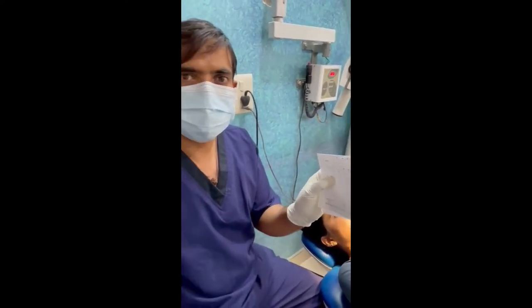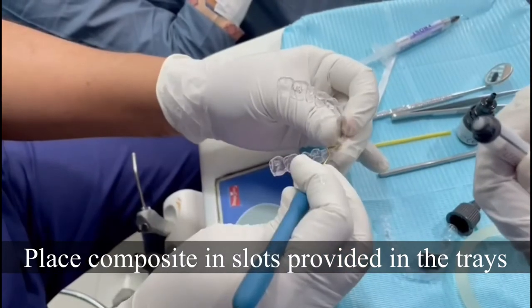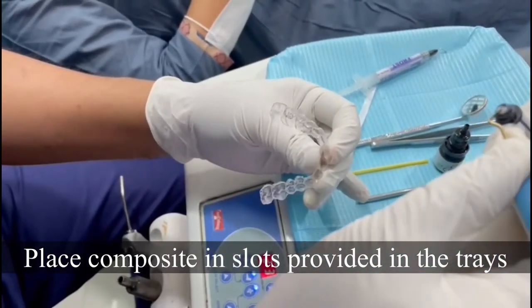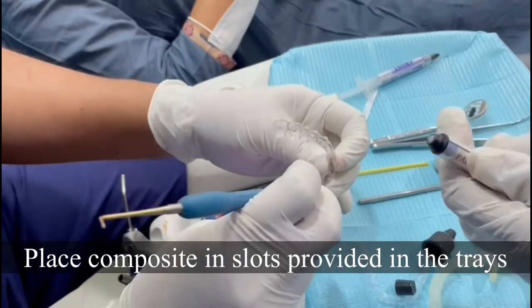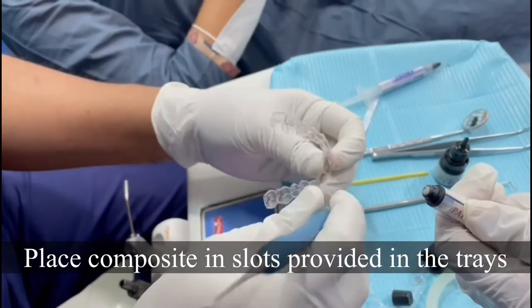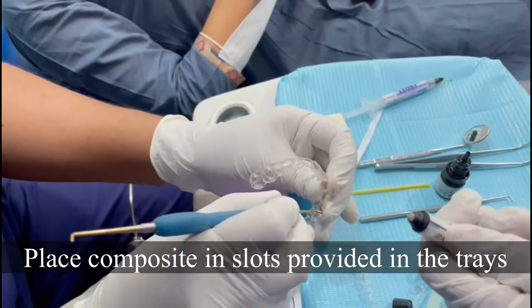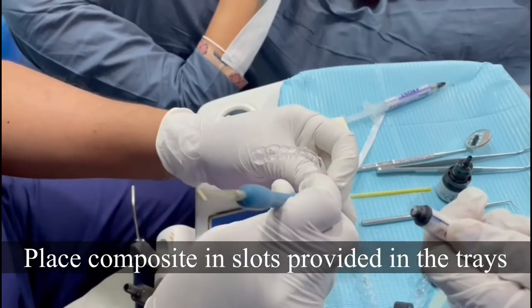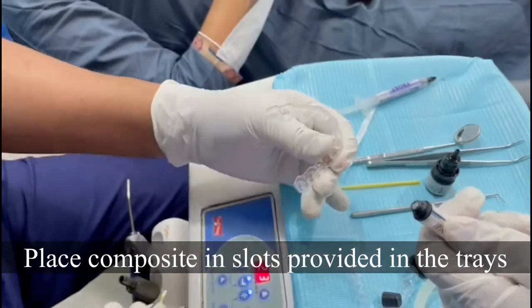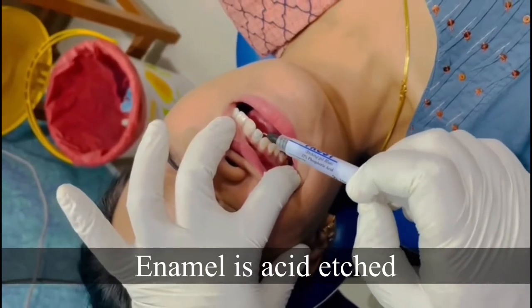We will do interproximal reduction as indicated in this chart. Since we have the attachments, we have the attachments in this chart and we are supposed to be etching this.